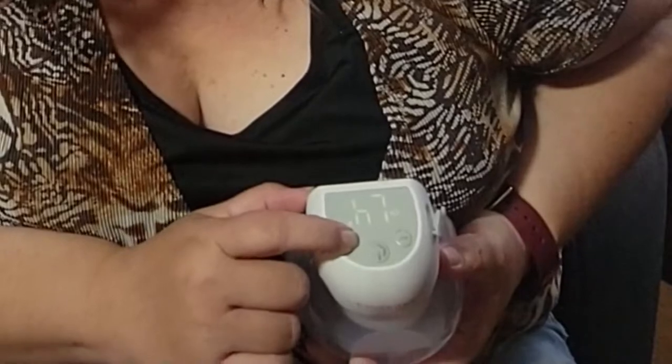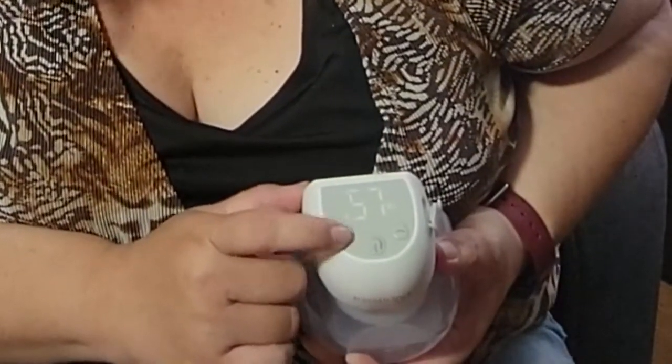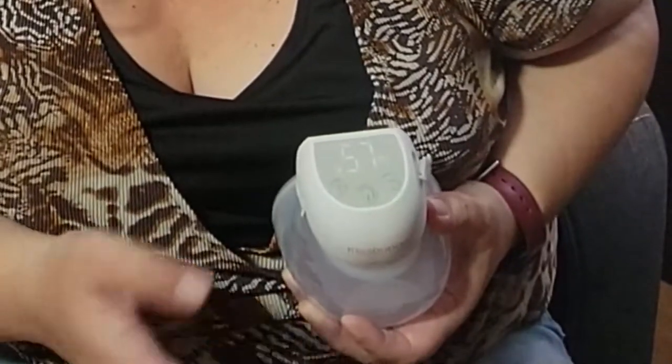Once you place it on, you turn it on and it starts slowly and gently. But if you need a little bit more power, you can just press the button and it'll gradually increase the suction so you can get it where it's comfortable and get the milk you need.